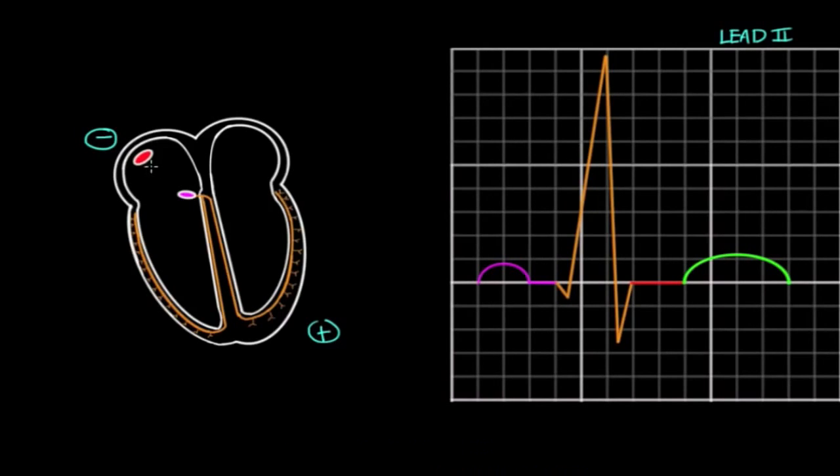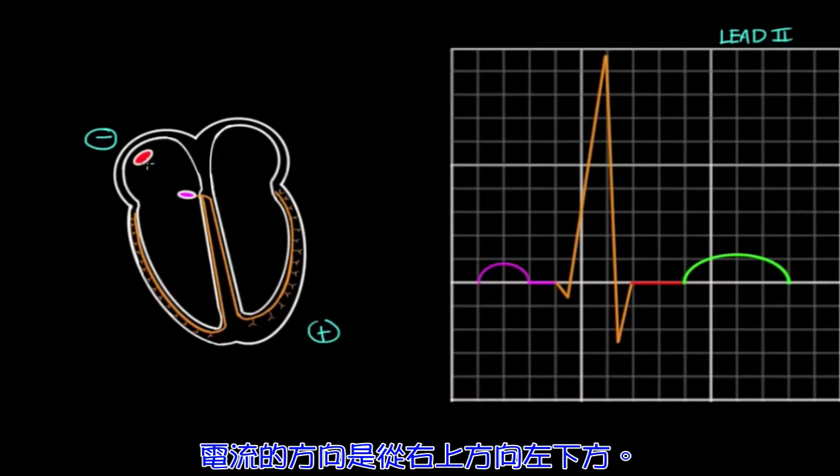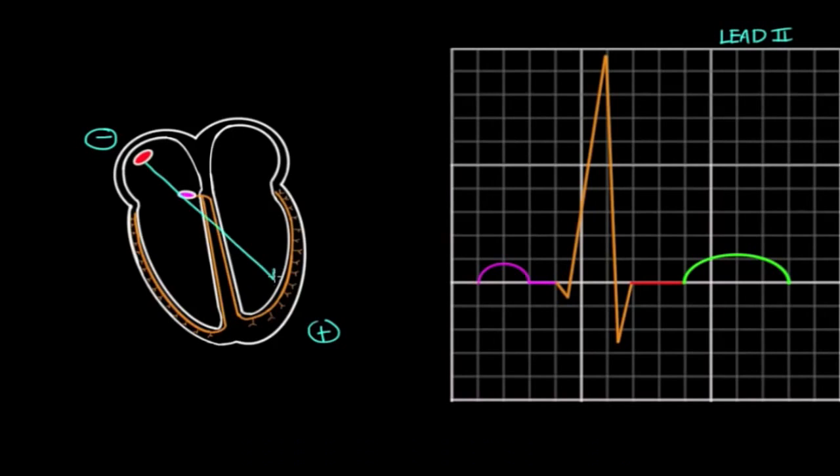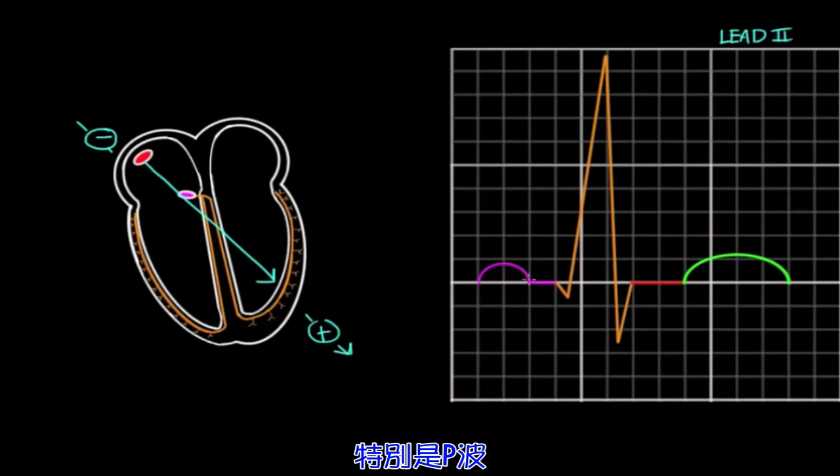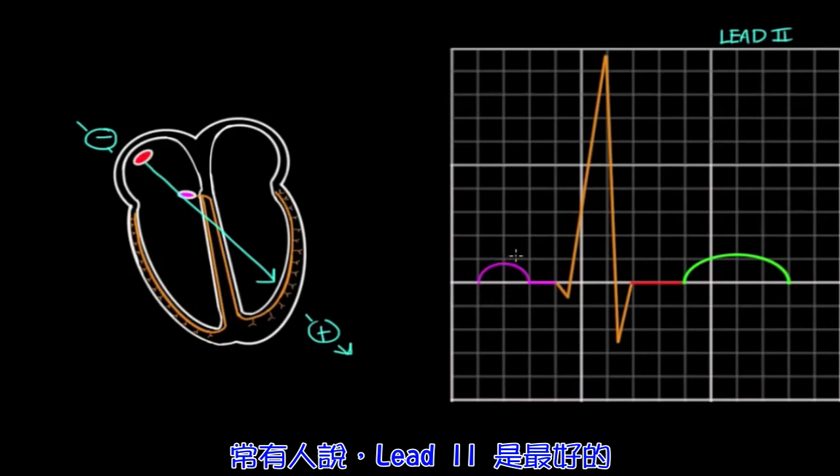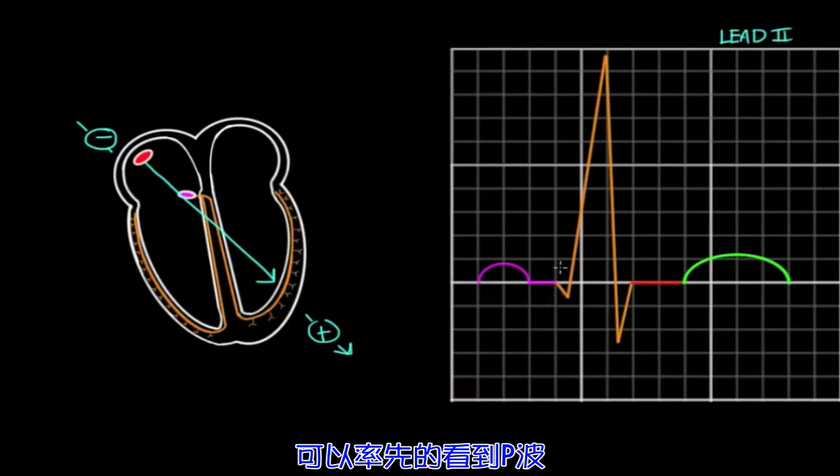Lead 2 has a negative electrode on the right hand and a positive electrode on the left foot. In a healthy heart, the wave of depolarization overall runs from the top right to the bottom left. So you can see that lead 2 measures voltage created in this direction. Therefore, lead 2 is commonly singled out for more simple information such as heart rate and rhythm, because it gives you a pretty good view of the waves, particularly the P wave. Often people say that lead 2 is the best lead to see the P wave.